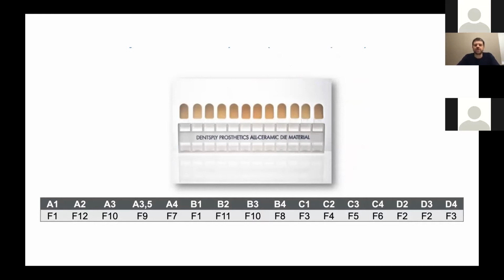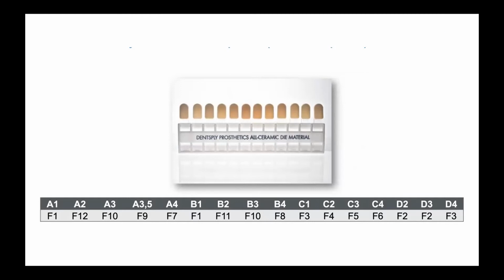Of course, everyone knows the classic way to mimic the shade of prepared teeth. This is the resin cement that is offered by every manufacturer. And we can use this material first of all, but this material can be individualized with composite stains, and please pay attention to this way too.